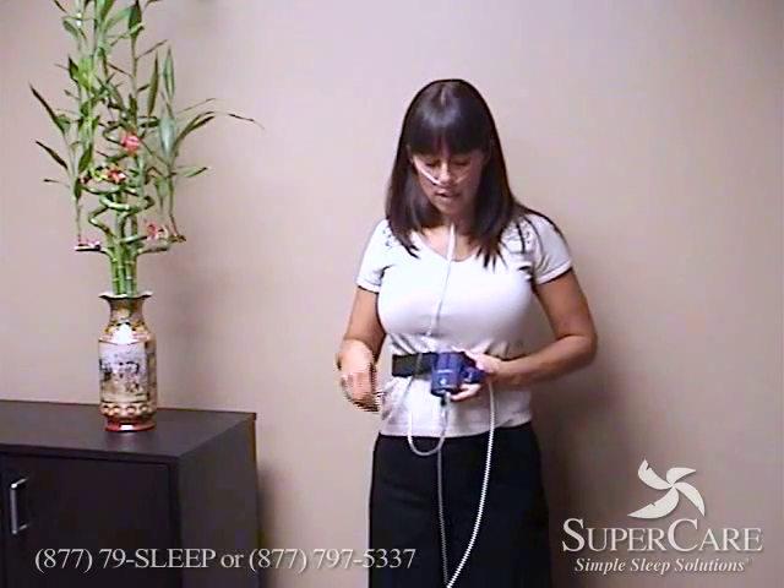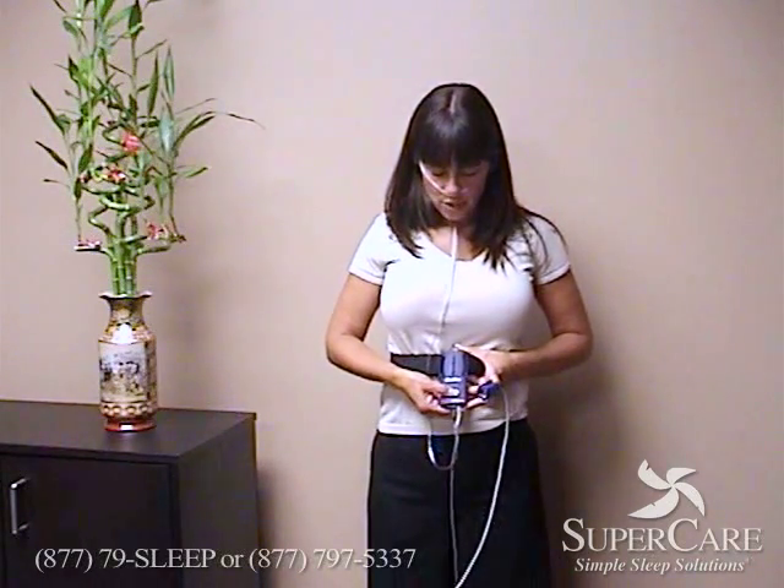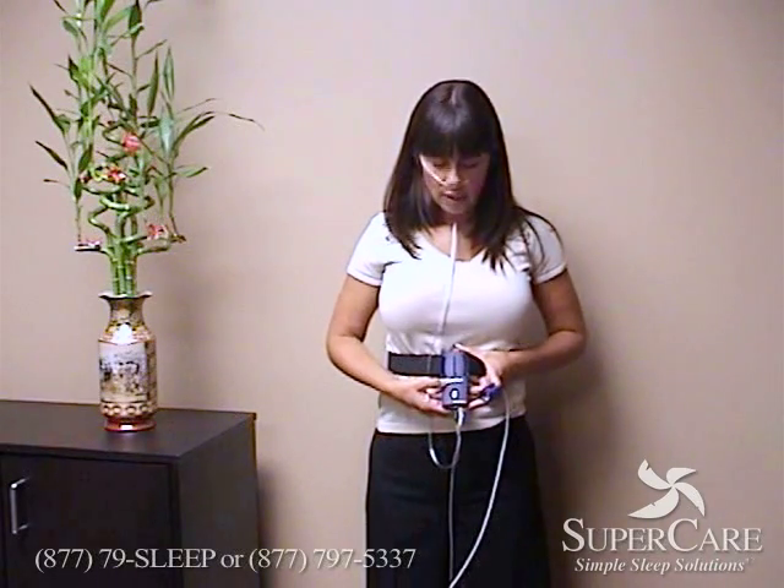When you're ready to turn the apnea link on, you're going to press and hold the silver button for about the count of three — one, two, three — and the light will come on.